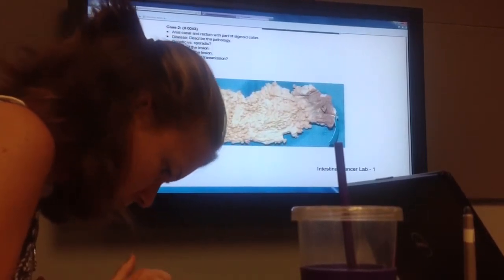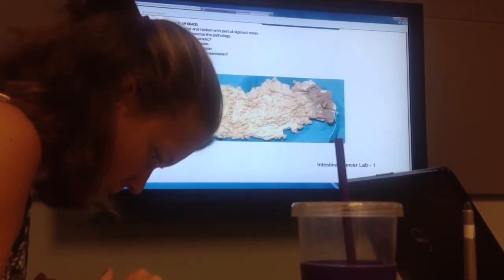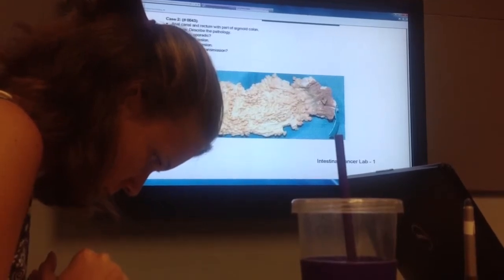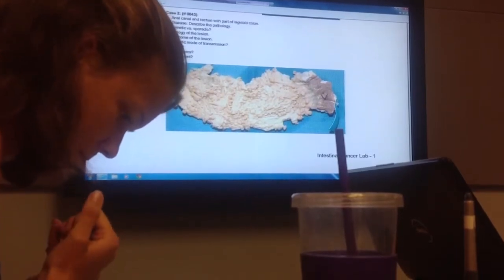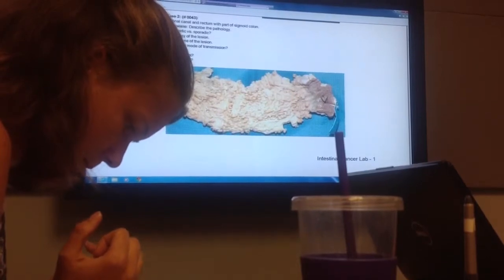Excellent. So this is saying, let's talk about the biology of the lesion. First of all, we've got all these polyps. Now, what's interesting is they didn't do a whole colectomy on this, right? So who knows why not, but anyway.